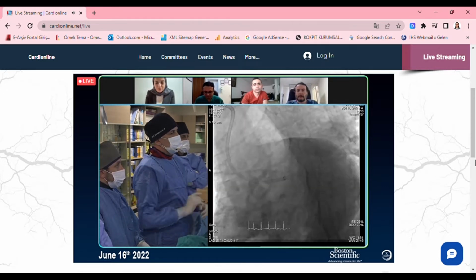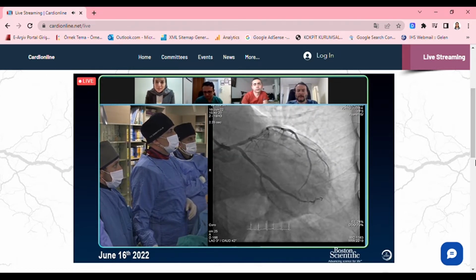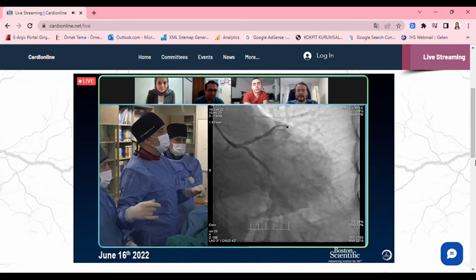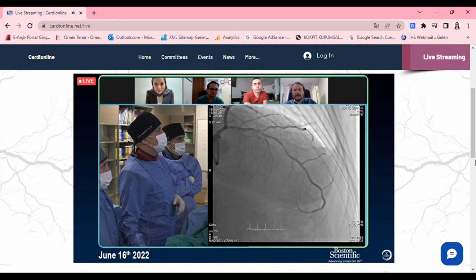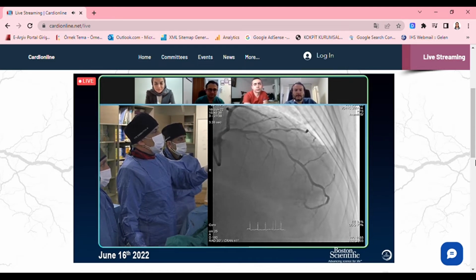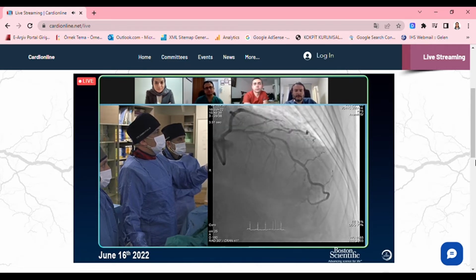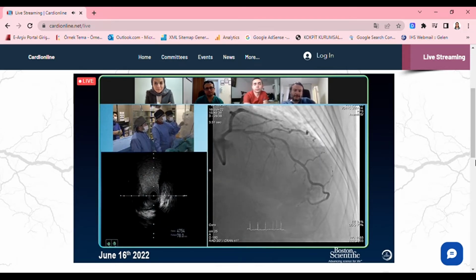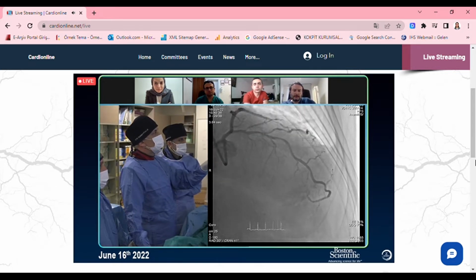We'll go around too before you jump into the case. Just going through the panelists here, Şevket, would you try balloons first and see what happens? Let me show you the fresh angio, and then you. I'd like you to discuss this case, and maybe I can show you the IVUS first. Oh, this is a long lesion. According to the angio, I think there could be a breach at the end of the lesion. We have first and second diagonals. The first diagonal is sizable, but the second one is a good diagonal. We have to take care of that one for sure.